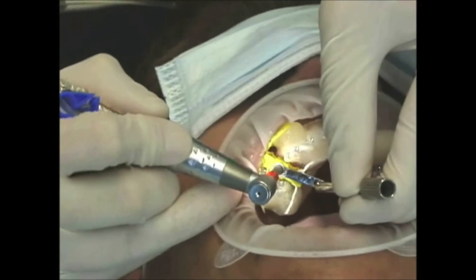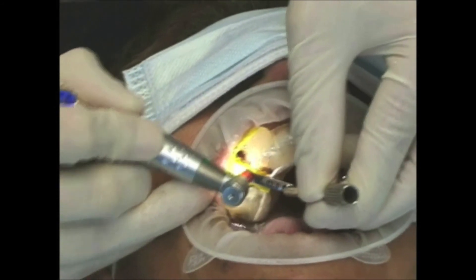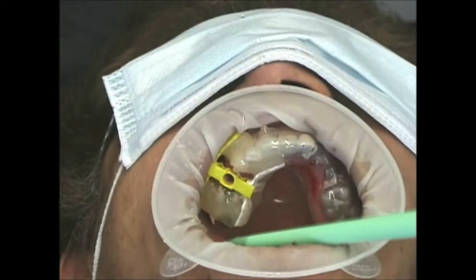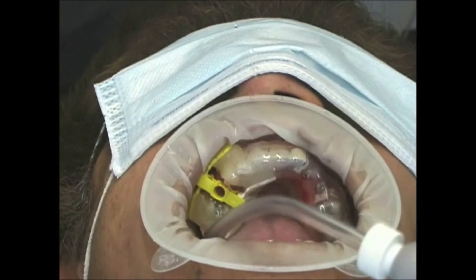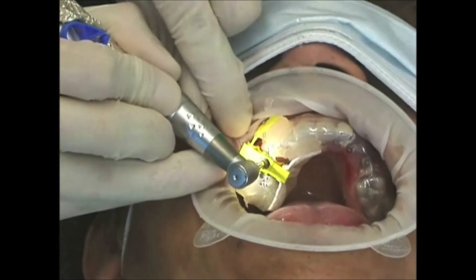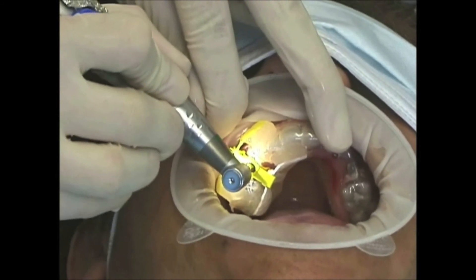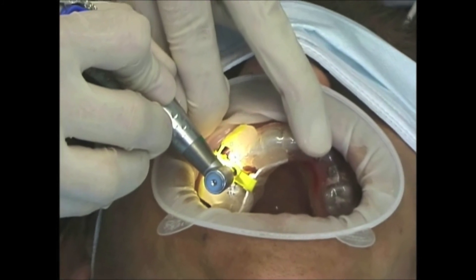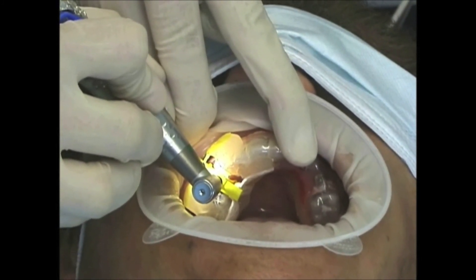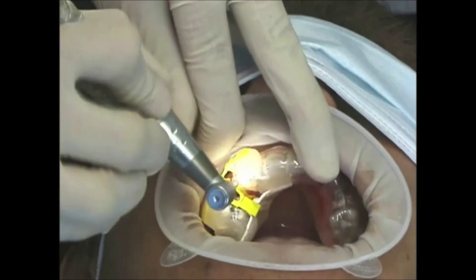The procedure begins. The osteotomy is completed, and the implant is now placed in a guided fashion. Total time confirmed: 48 seconds.